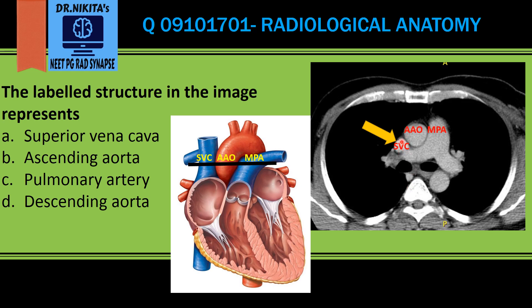On the right side is the SVC, in the middle is the ascending aorta, and to the leftmost is the pulmonary artery, which divides into the right and the left pulmonary artery. So the labeled structure here represents the superior vena cava, that is the SVC.